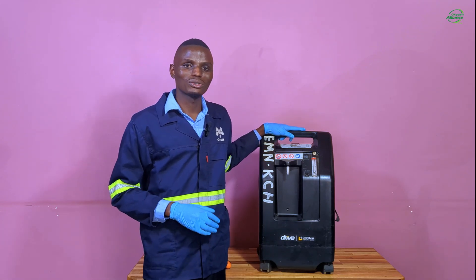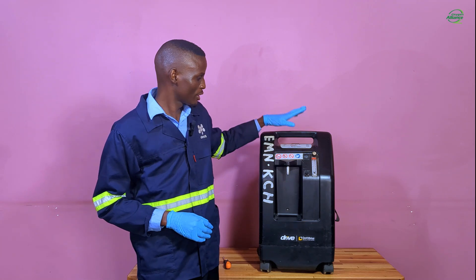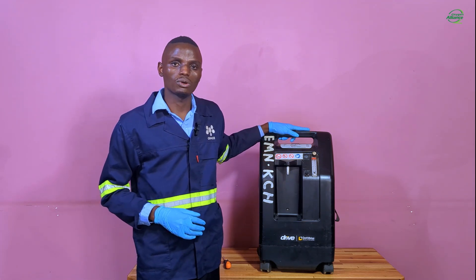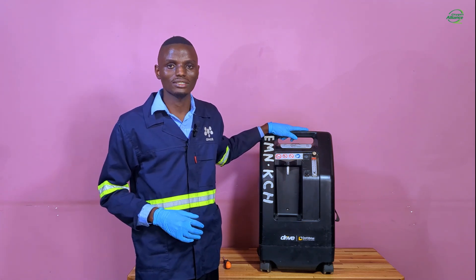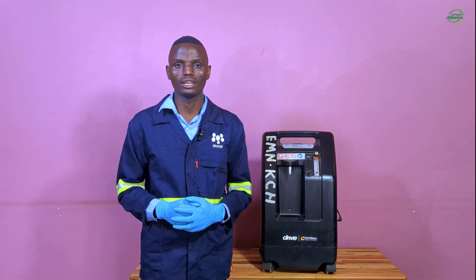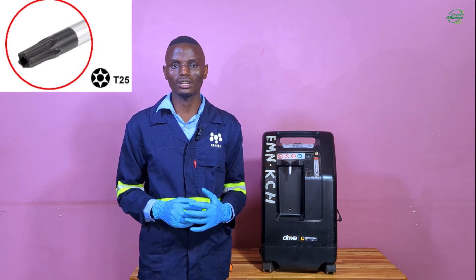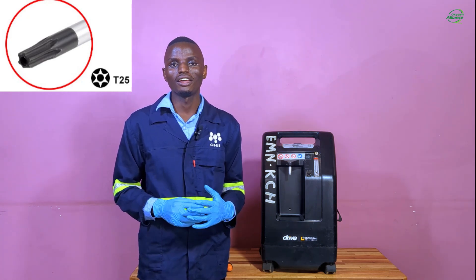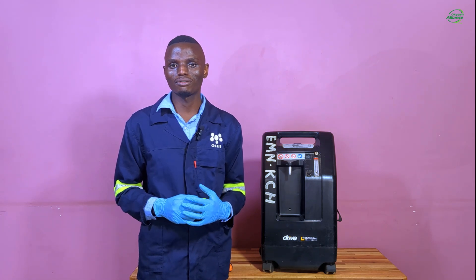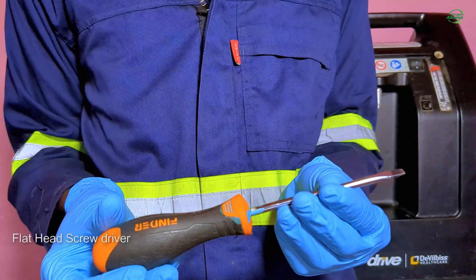Now I'll make a demonstration of how to perform this test. Make sure your oxygen concentrator is switched off before you start this process. To successfully perform this test, you require the following tools: a T25 screwdriver for opening the oxygen concentrator cabinet. If you don't have a T25 screwdriver, you can use a flathead screwdriver.